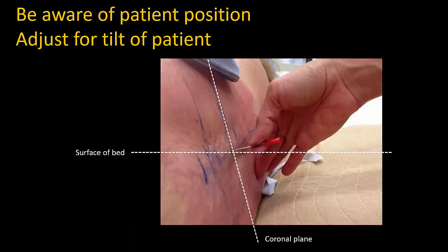The same applies in the lateral position. If the patient is leaning away from you, and sometimes this is actually an advantage because they are then more stable, then this must be taken into account when advancing the needle to keep it in the midline.